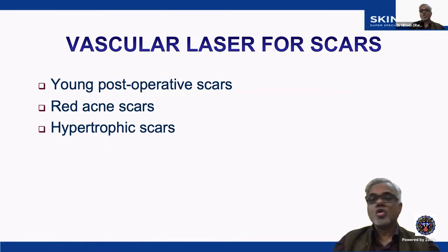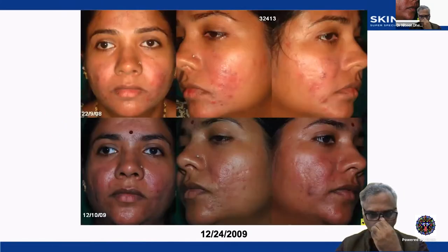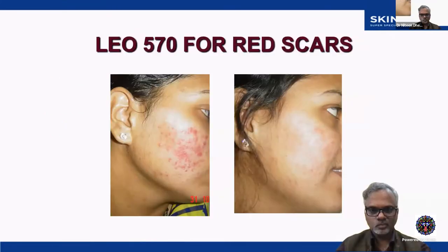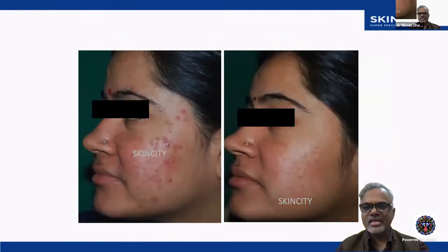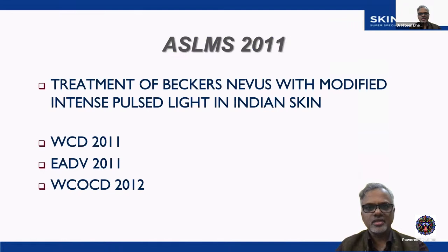Vascular laser for scars: for the red scars, the young early scar, a vascular-specific IPL can be used to prevent erythema in the young scars.